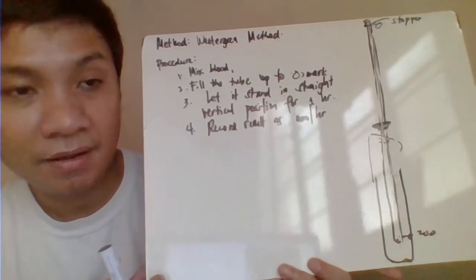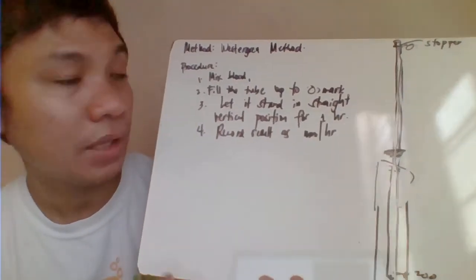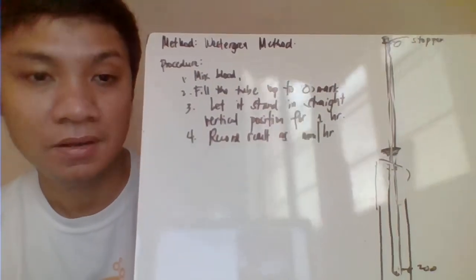Okay, that's for your Westergren tube. So thank you.